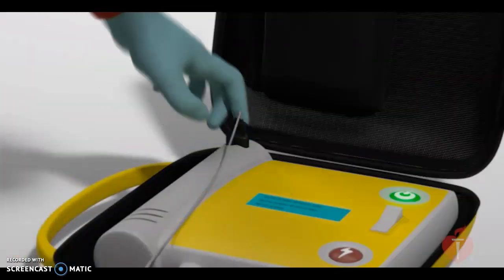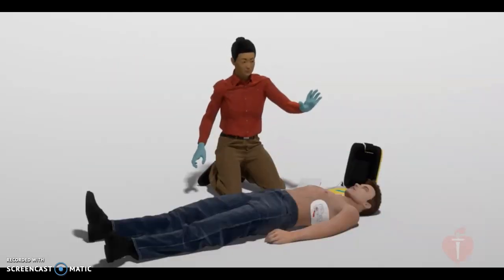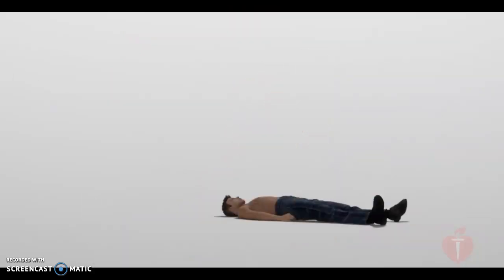If the AED recommends a shock, it will tell you to stay clear of the person. If the AED tells you to clear the person, then loudly state, "Clear." Look to be sure no one is touching the person just before you push the shock button. As soon as the AED gives the shock, immediately resume chest compressions. Following this demonstration, you will have a chance to practice using an AED trainer, just so you can see what it's like.